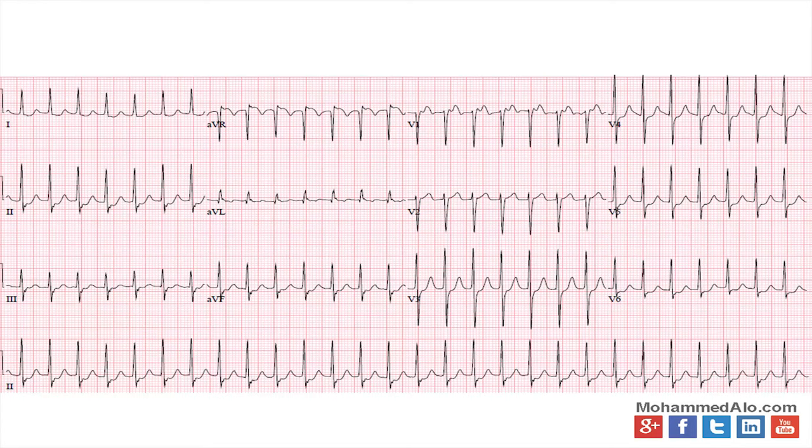Next one here looks like another AVNRT. You see ST depressions and ischemia throughout. Remember, ischemia does not localize. You see V2 and V5 are the most sensitive, so you definitely see ischemia there, and that would be what I would lean towards.